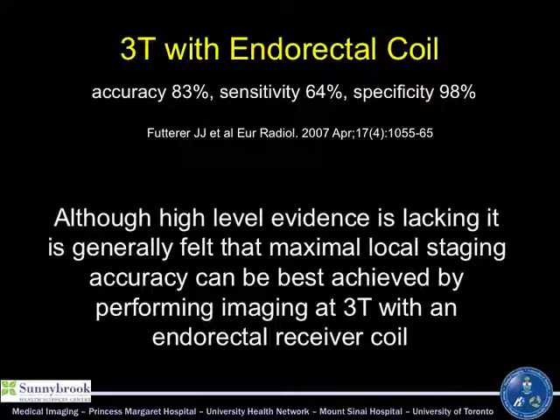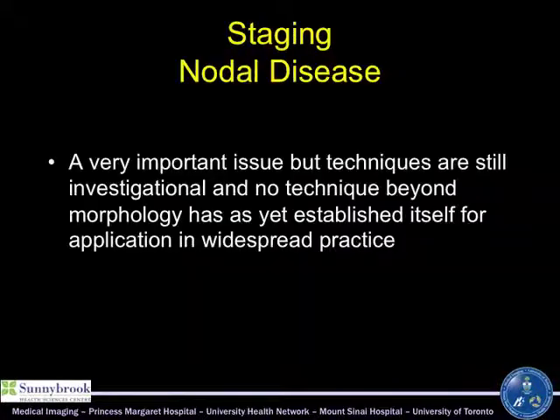So if we call extraprostatic disease as radiologists, it means our certainty level is very high. But if we don't call it, then there's a chance the patient does have it, but we just can't see it.